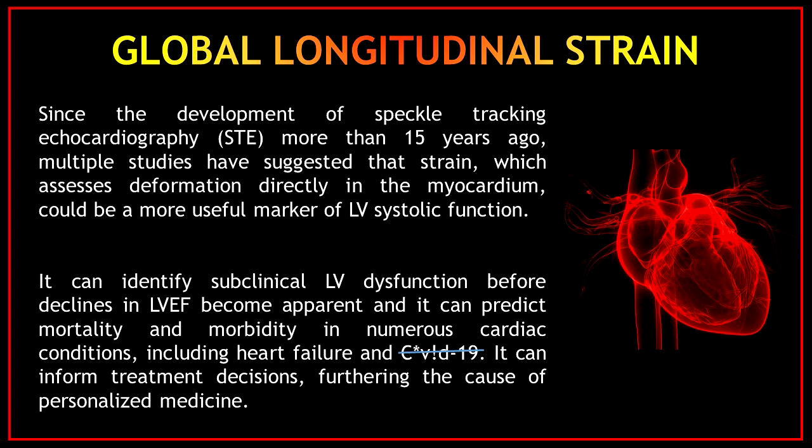Global longitudinal strain can identify subclinical left ventricular dysfunction before declines in left ventricular ejection fraction become apparent, and it can predict mortality and morbidity in numerous cardiac conditions, including heart failure and, of course, this famous virus. Also, it can inform treatment decisions, furthering the cause of personalized medicine.